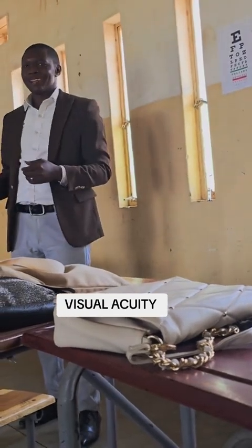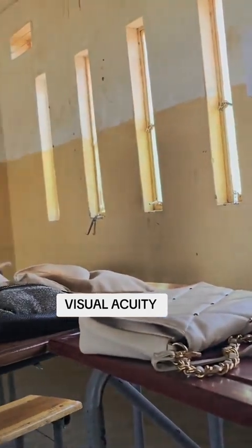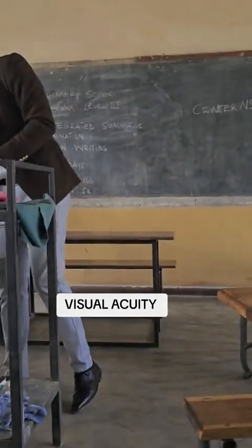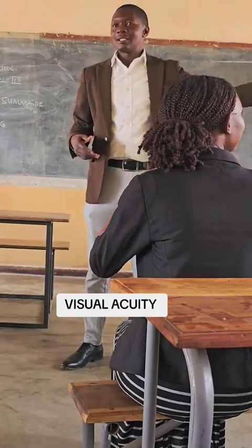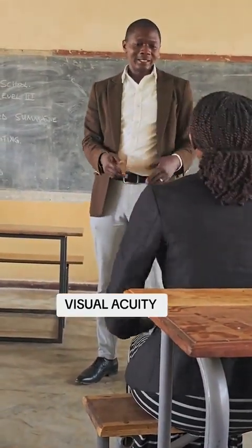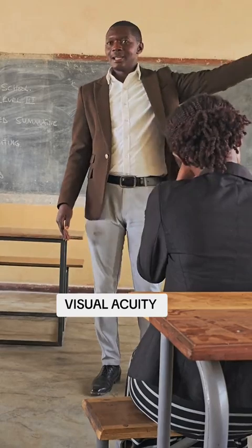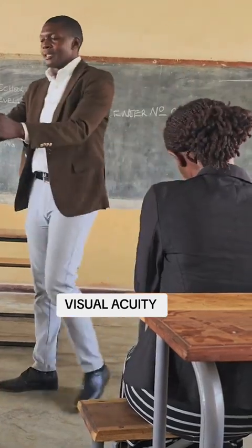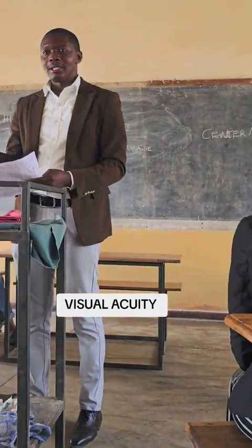Who's going to be the standardized patient? You can come. There's an actual patient, then there will also be a seat for you. Then there is a Snellen chart stack and there is a table with plain papers which you are going to use to record.